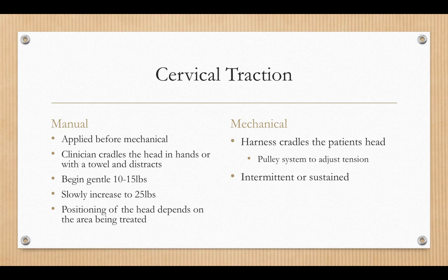So again, there's some videos showing some different varieties of positioning. But that harness cradles the patient's head, and the pulley system is set up to adjust for the tension. So again, ours, we use a pump to create that, but on the machines, it would be a pulley system with a motor. With the mechanicals, we can do intermittent or sustained. So we could do like our 30 seconds on, 10 seconds off kind of situation, or we could just set it and treat. And that could be anywhere from 5 minutes up to potentially 45 minutes, depending on the treatment that they would need.